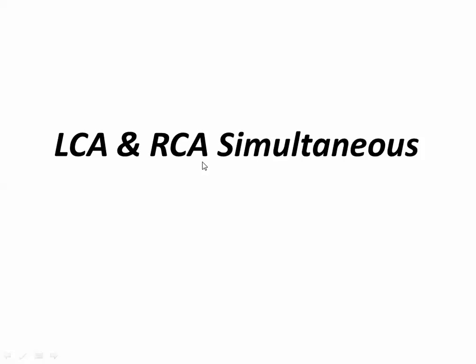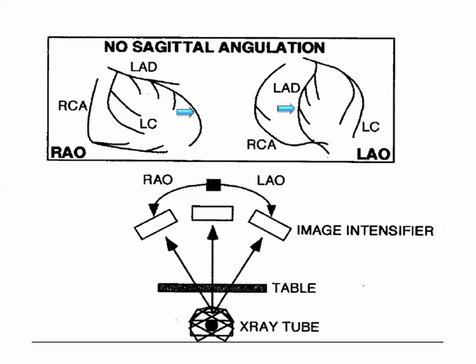We take RCA alone and LAD alone. We will take both simultaneously. Okay.